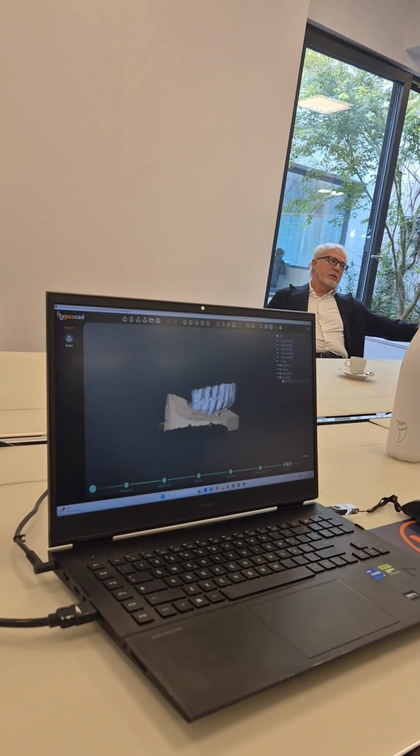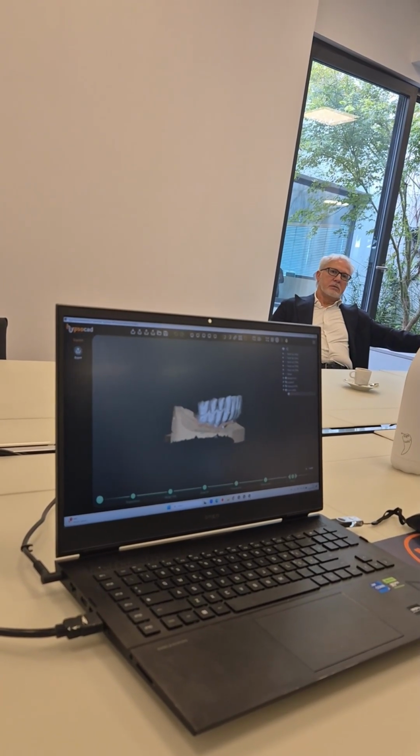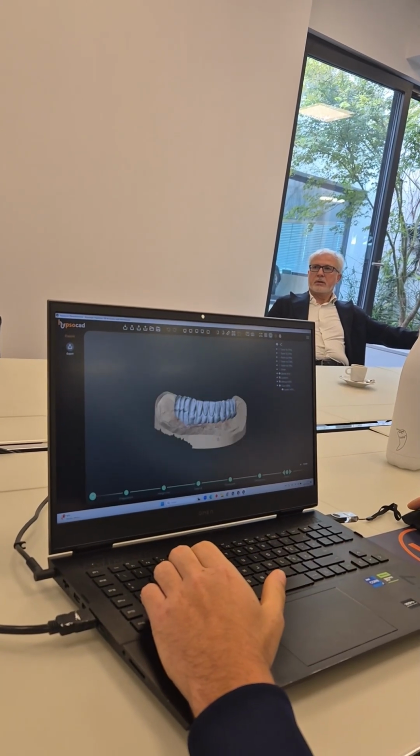Yeah. Okay, after this one, can you please show me a quick demo for full dentures? Okay. Sure. Please go with your schedule, but maybe if it's possible. Can I just add, sorry, one other thing? Yeah.